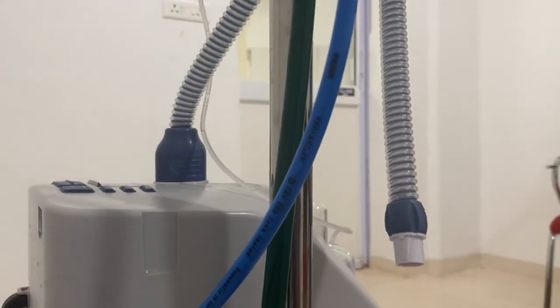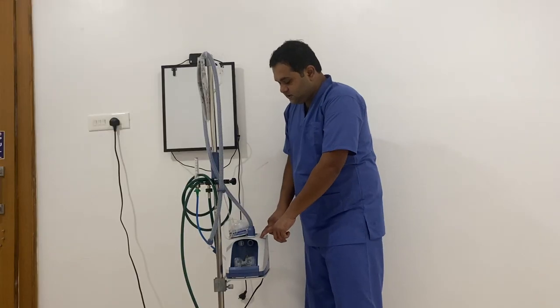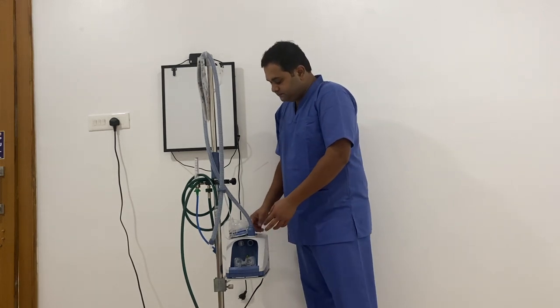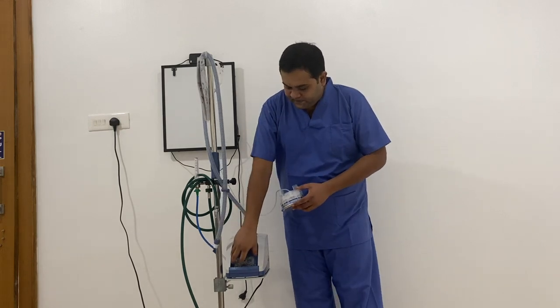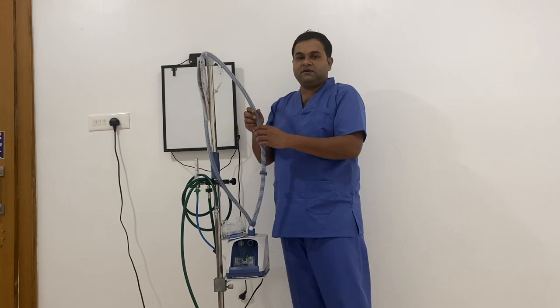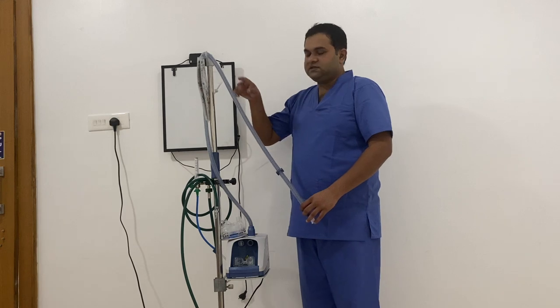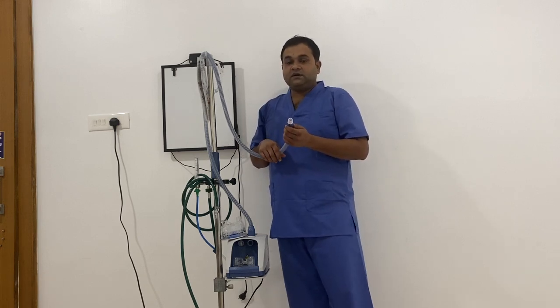This is the connector from the flow meter to the machine. This machine is a humidifier and also the flow generator. This is a water channel, and this is a connector that connects the water chamber to the humidifier. This is an air piece that collects gas flow from the humidifier and delivers it to the patient. Here we connect the patient interface — it can be an adult interface or the pediatric interface.